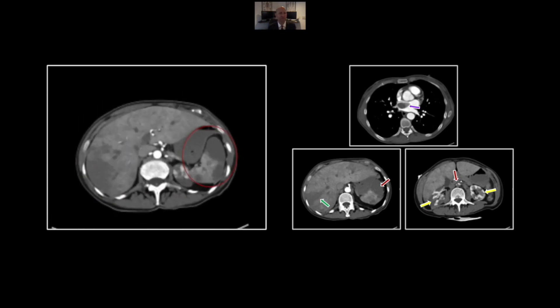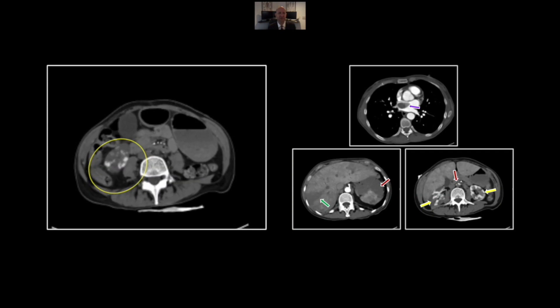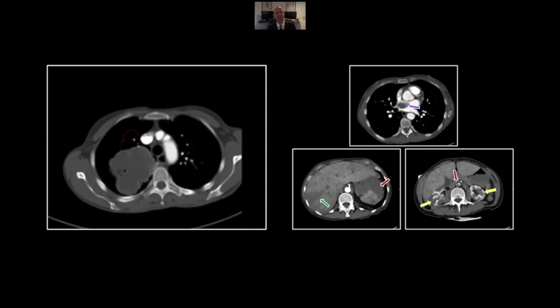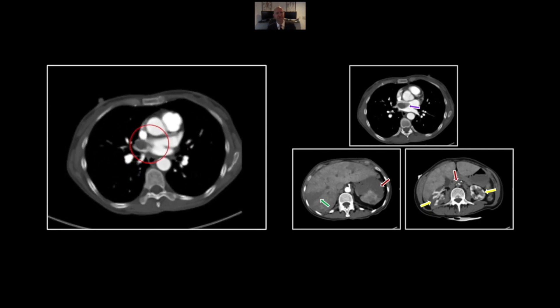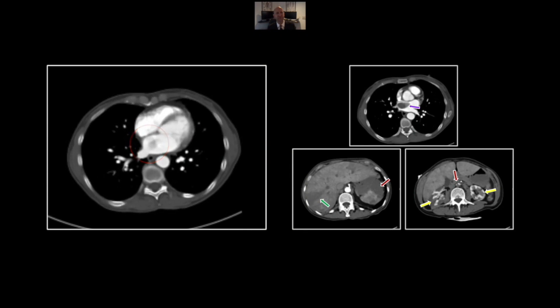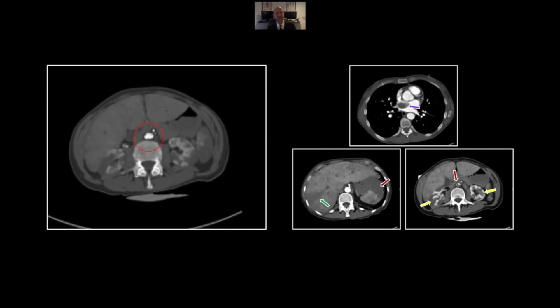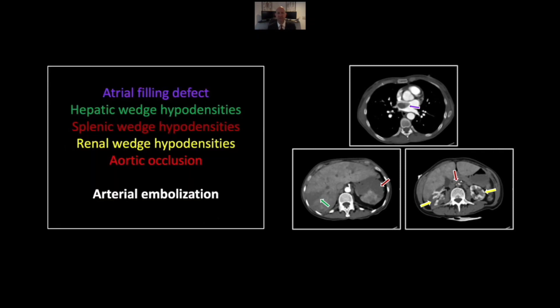Let's look one more time. Here are the emboli of the liver, spleen, and kidneys, and the right upper lobe mass extending down the pulmonary vein into the left atrium, and ultimately the occlusion of the distal aorta. So that is a case of arterial embolization related to atrial tumor thrombus.